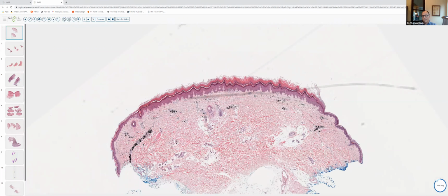So we've looked at 3 hemostatic agents: aluminum chloride, which is characterized by the blue-gray granules in the cytoplasm, not much of an inflammatory infiltrate, and a little calcium deposition. We've looked at Monsel solution, in which you do quite a bit of fibrosis, and within and beneath the zones of fibrosing granulation tissue, pigment-laden macrophages containing kind of brownish to refractile granules that vary in size.